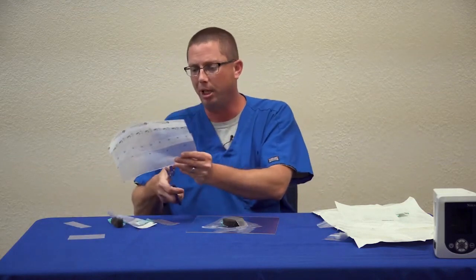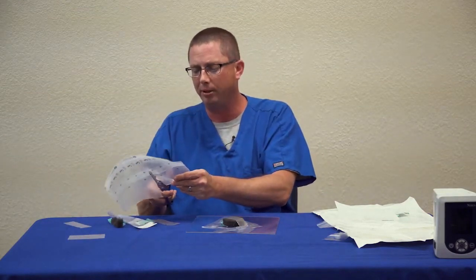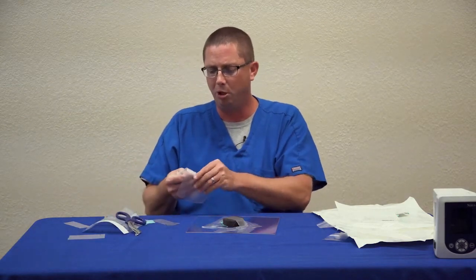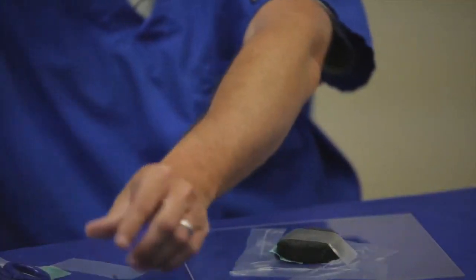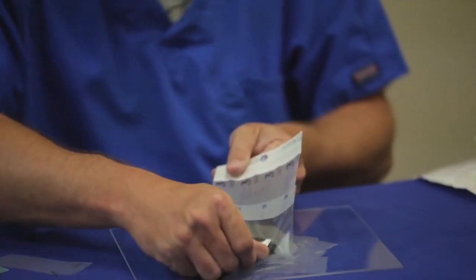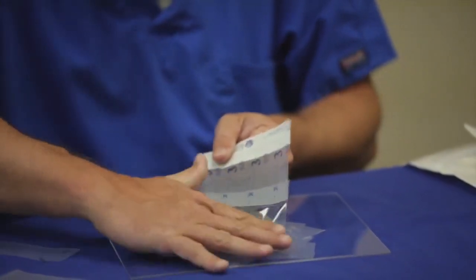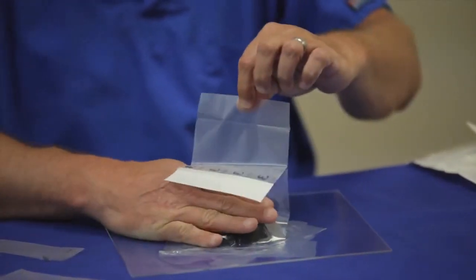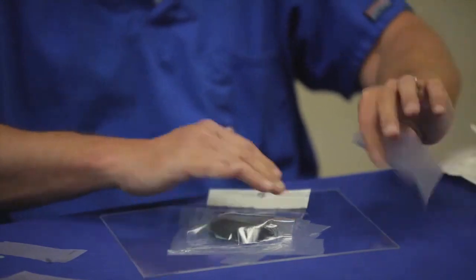So I come back to my drape. I'll cut about a 4-inch piece on this wound simulation. Remove number 1, adhere that to the wound. Again, I'm not pressing on the foam. Remove number 2, walk that over.